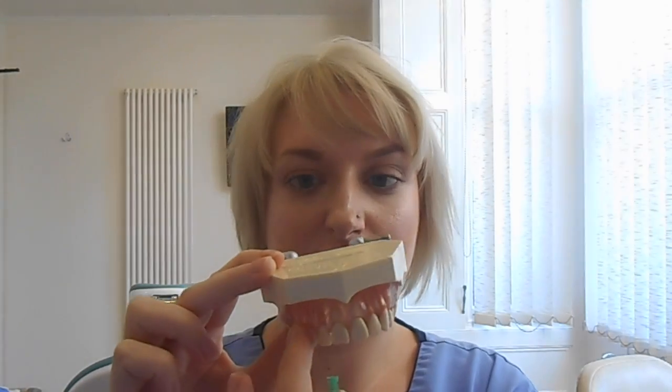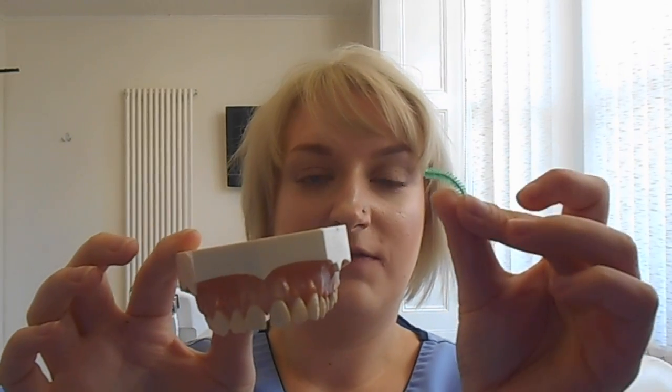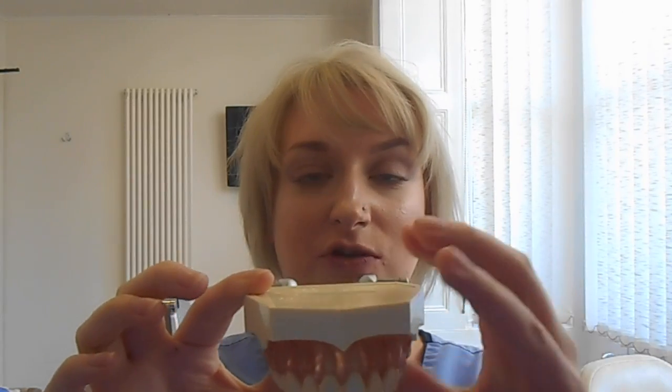You have to use the brushes on the top right, so it's exactly the same kind of grip, but you're using the brushes this way. So you want the bristles and the curve to be pointing upwards rather than at the bottom when the curve is pointing downwards. Okay, so we're pinching together in between our thumb and our index finger on the left hand for the top right, and we're coming round inside the cheek, fingers on the outside, and popping the brush in between the two teeth and feeding it through. This brush is too small for this, but just for demonstration purposes it's a little bit easier. And to get it out, it's up, up, up, up, and it will come out like that. Okay, so the curve this way is exactly the same on the top left, but you're using your right hand to come round, and on the bottom left again you're using your right hand with the curve pointing upwards.